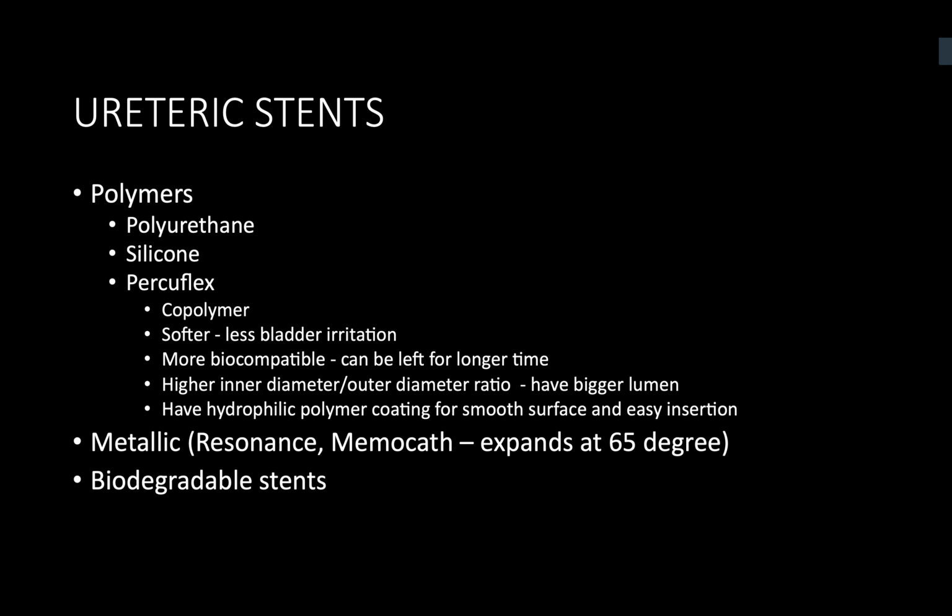Okay, well done. Regarding the answer, there's a good chance that you will get a stent question in the exam, especially in the technology table. I put a PowerPoint slide based on this in the discussion. I would suggest that whenever you are asked about stents, if there is a question like what are the types of stents you are aware of, then you can say that there are stents based on polymers, there are metallic stents, and there are biodegradable stents which are not commonly used. And in the polymers, the most commonly used ones are polyurethane, silicone, and the copolymer stents. If you give it in a systematic order, then you can score high marks.